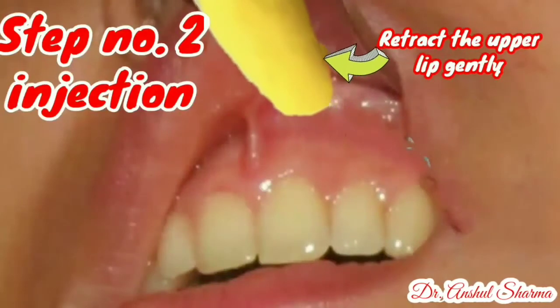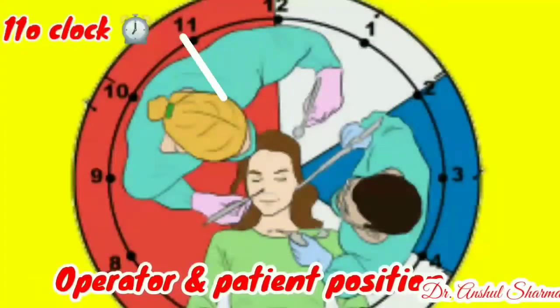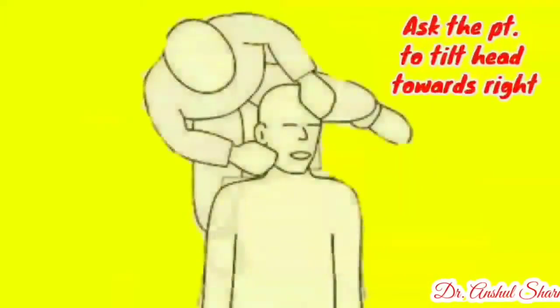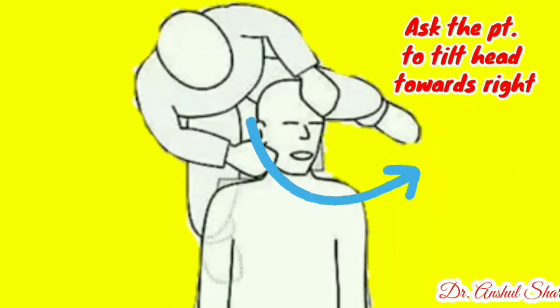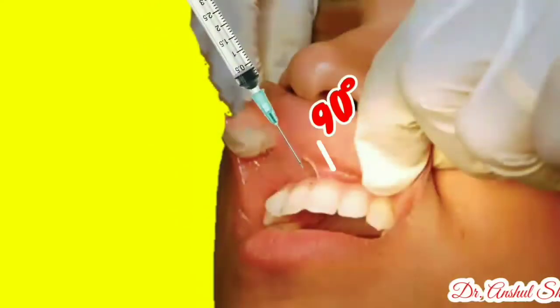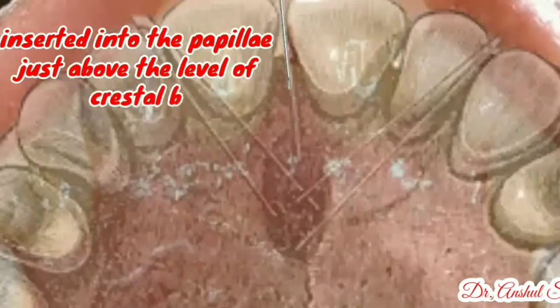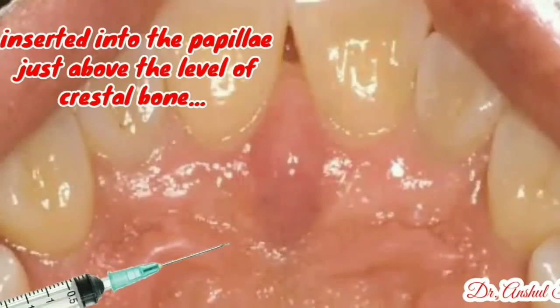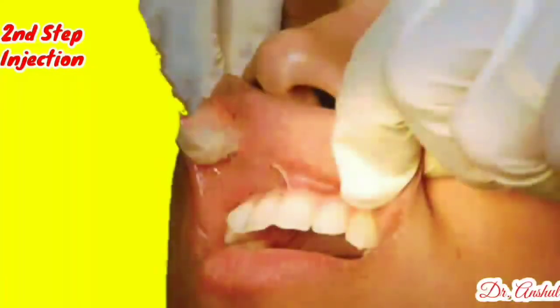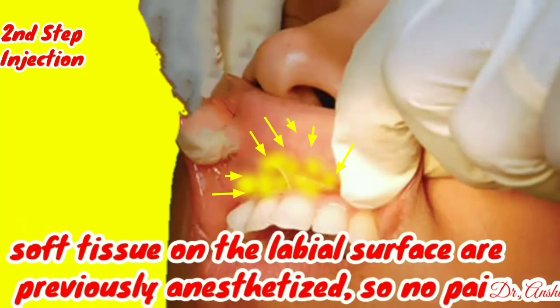For injection number two, retract the upper lip gently to increase visibility. The operator sits at the 11 to 12 o'clock position facing the same direction as the patient. Ask the patient to tilt the head to the right to provide the proper angle for needle penetration. Hold the needle at a right angle to the interdental papilla, insert it just above the level of the crestal bone, and direct it towards the incisive papilla. Soft tissues on the labial surface have previously been anesthetized, so there will be no discomfort.